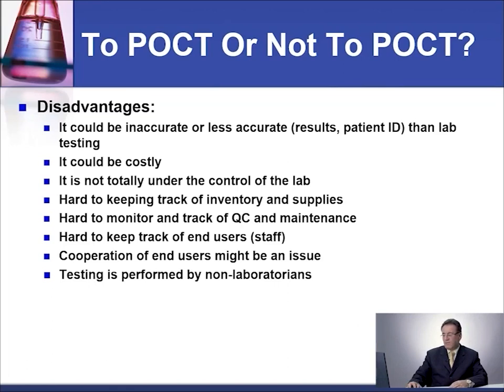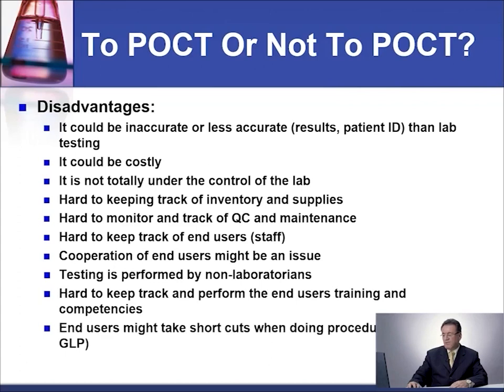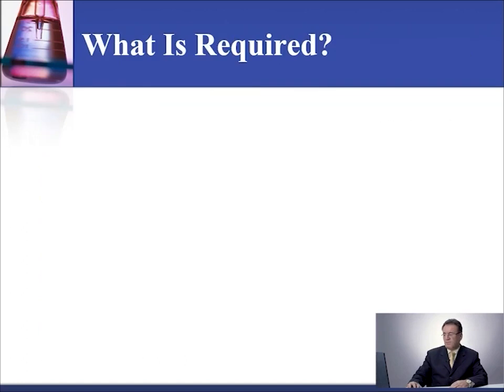Testing is performed by non-laboratory staff. Hard to keep track of and perform the end user training and competencies. End users might take shortcuts when doing the procedure, not following the written policy or good laboratory practices. So these were the disadvantages of using point of care testing.